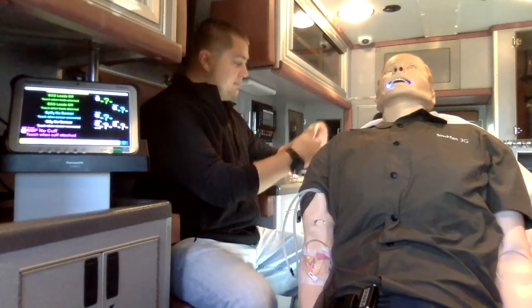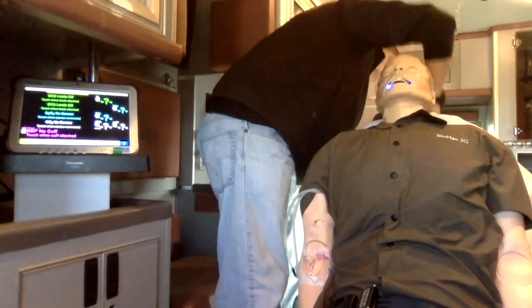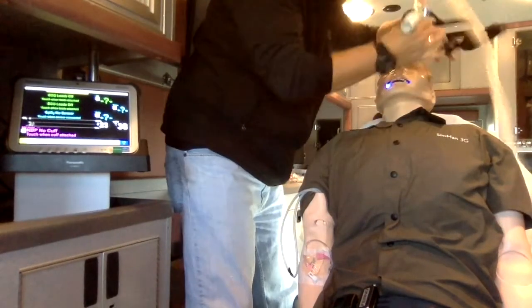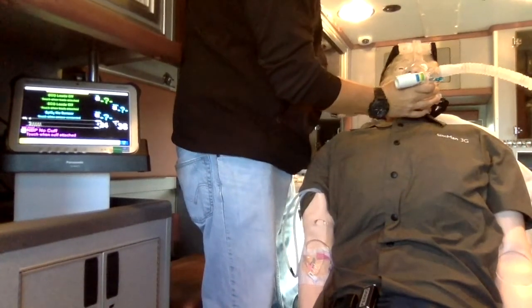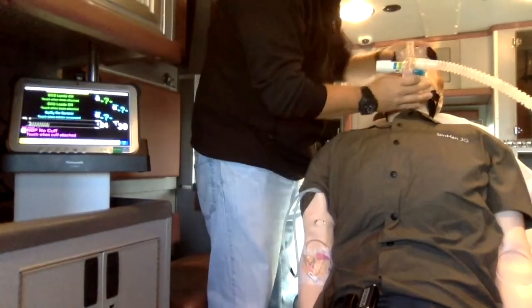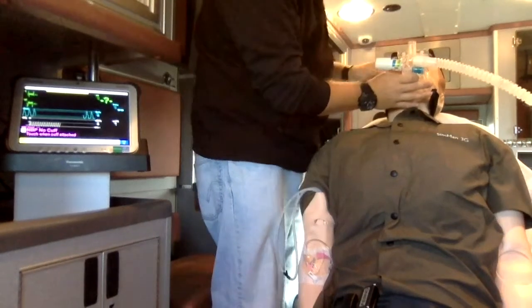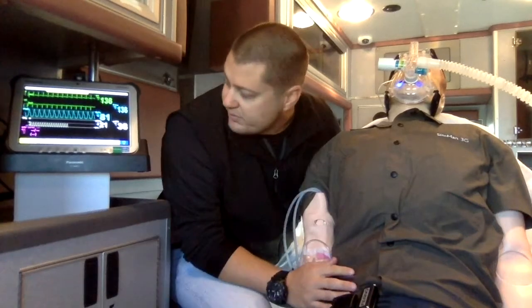So the first thing I'm going to do here is I'm going to apply nasal end tidal, and CPAP right off the get-go. And while I'm doing this, my partner's going to put them on the monitor. We're going to run our first set of full vitals. So let's see what we see here.